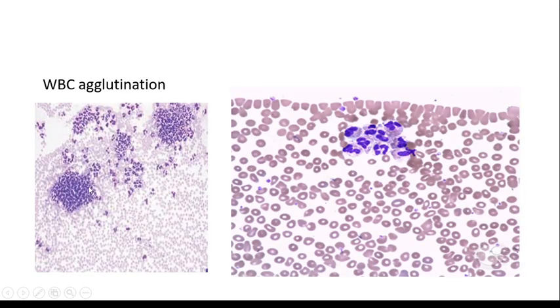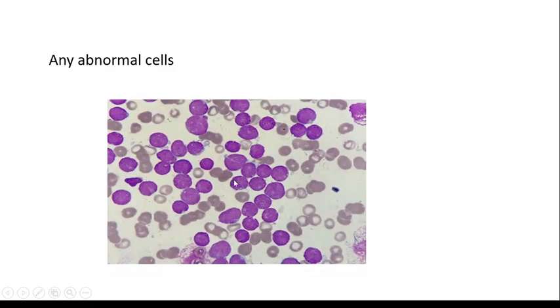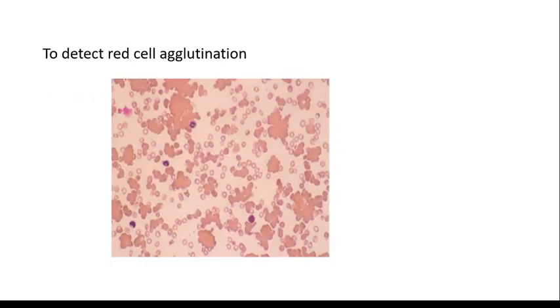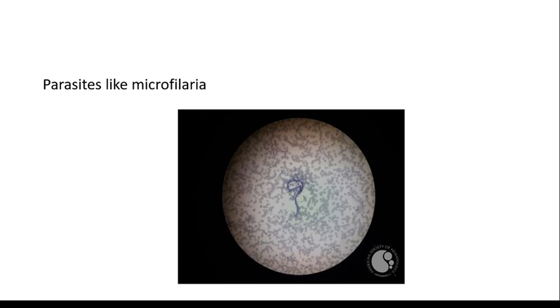WBC agglutination can be seen at the edges and tail end of the film. If a few abnormal cells are present, it is easy to find under low power. Rouleaux formation and red cell agglutination can be identified under low power. Sometimes, you can see parasites like microfilaria while scanning the slide.